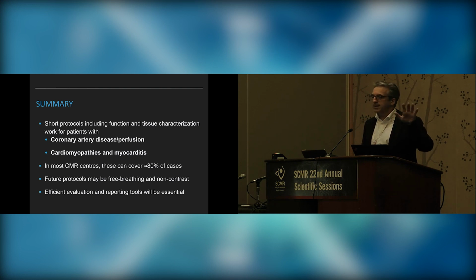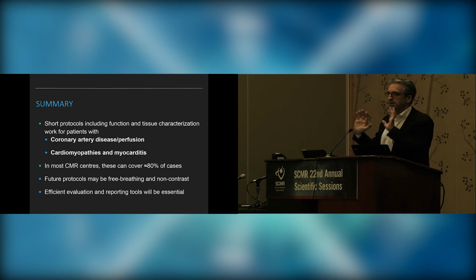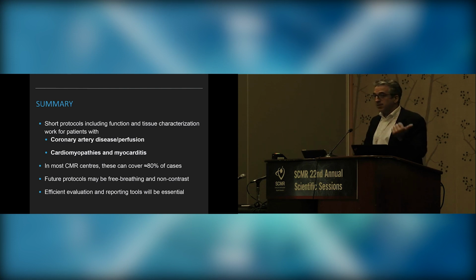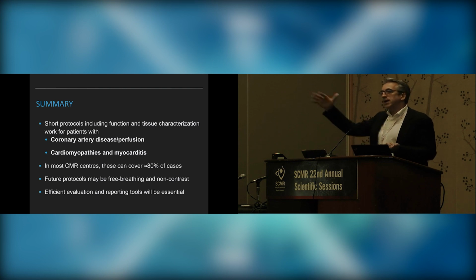And I have often recommended in the past to people when they get started in CMR, say, forget about all that. Just offer your doctors a viability scan to start with. And just do cine and late enhancement, that's it for now. Now with the mapping technology being more and more robust, that could be easily expanded. If you have a good mapping solution, and you know the normal values of your scanners, and you have a tool that provides you the maps, then just add that. That's already possible right now, and then you can expand from there.